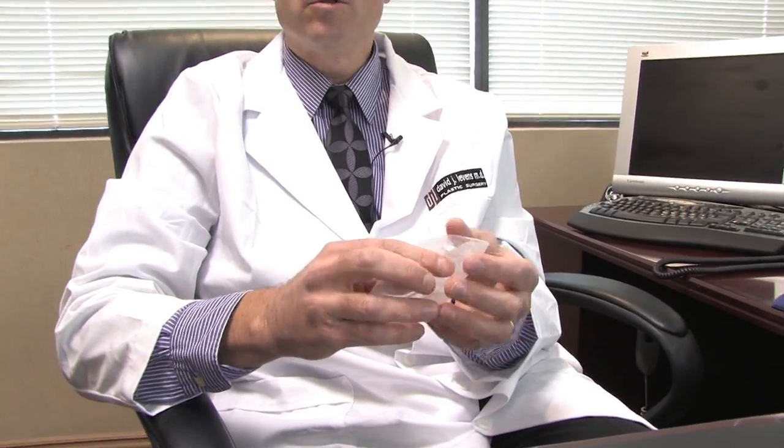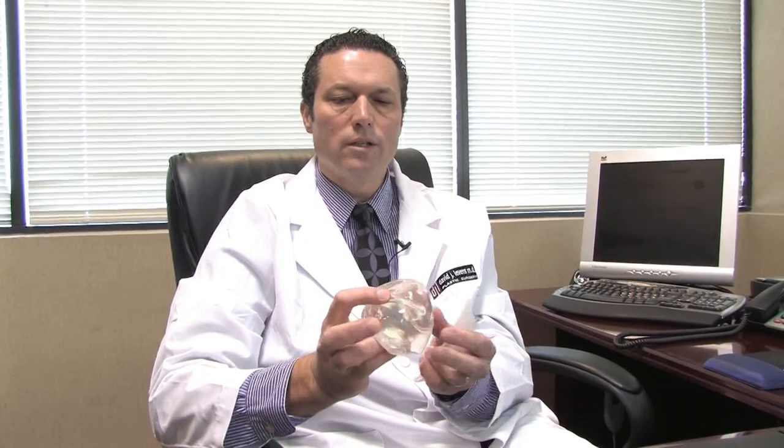One of the advantages of saline implants is that the implant can be placed through a very small incision, and therefore the scar on the person's breast can be smaller, possibly than when using a silicone implant, which is pre-filled and therefore requires a larger incision to place.